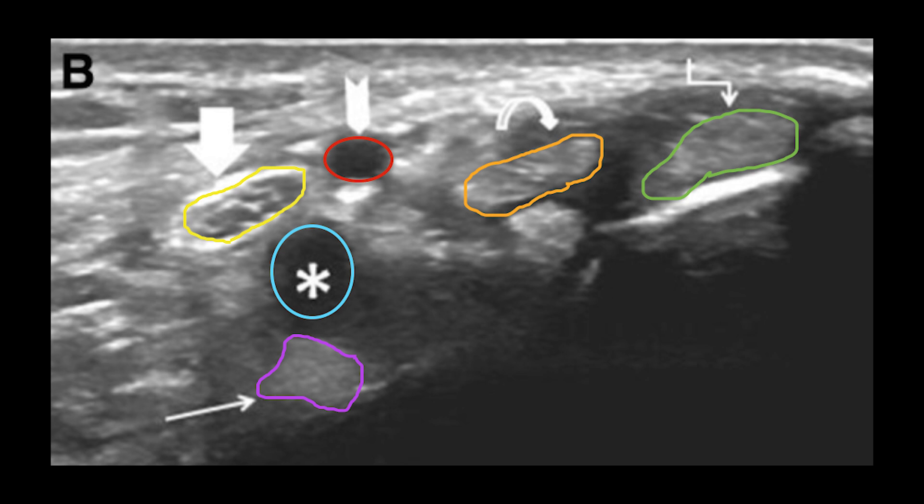Going back to the tibial nerve, you're able to identify it as a nerve because of its classic honeycomb-like appearance. Honeycomb reveals small hypoechoic areas, or dark areas, separated by hyperechoic septi, which appear white.